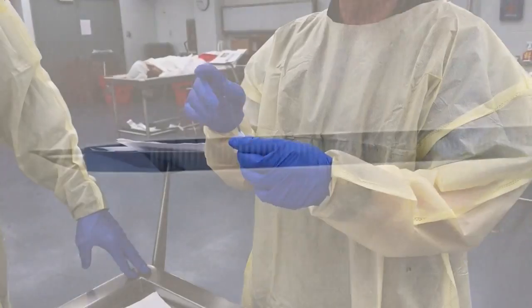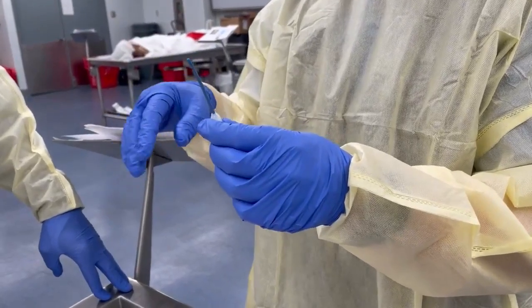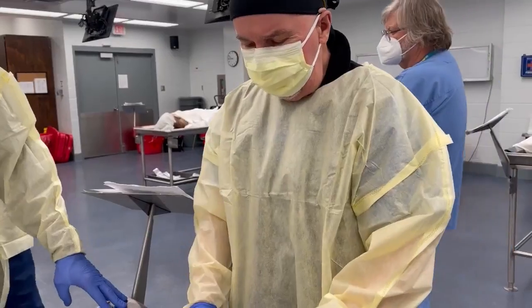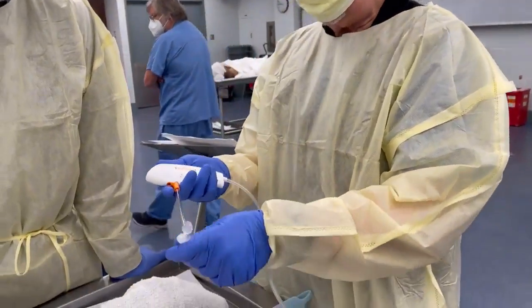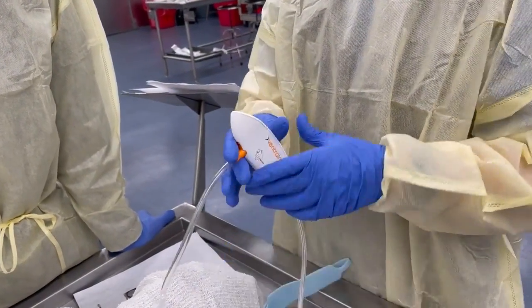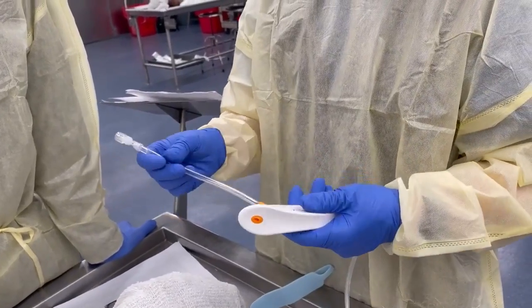Most of the 14-gauge catheters we use for transtracheal jet ventilation can kink and bend. The Ventrain device is a device that I think is perfect for transtracheal jet ventilation.